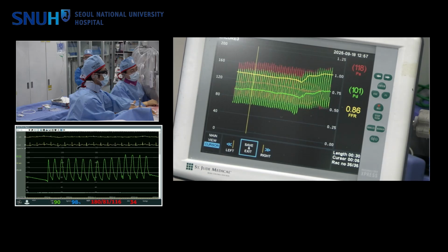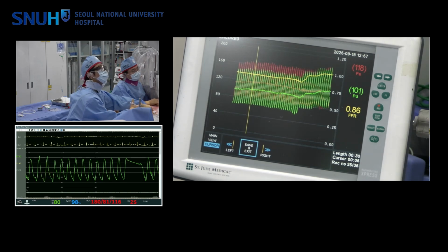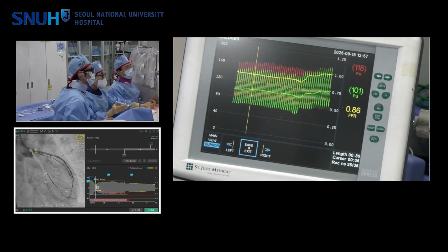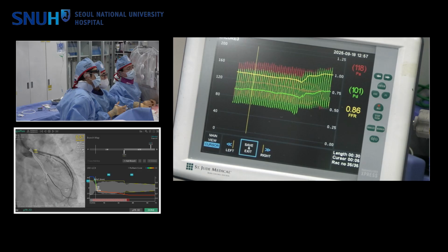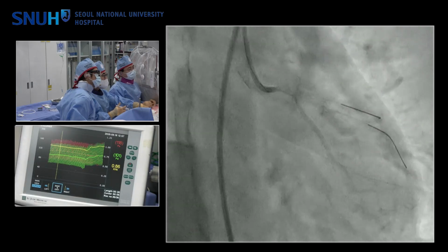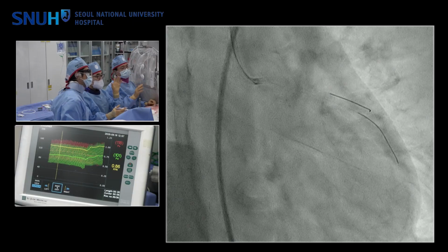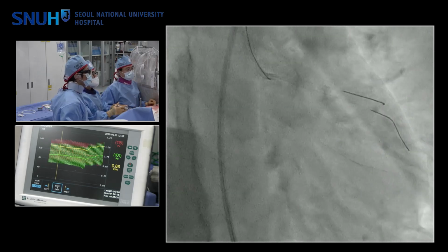How about taking the spider view to obtain a straightened LCX coronary angiogram? Okay, yeah. The foreshortening and the overall view is very good. Okay, test. Okay, we are going to take two MUFR views, the cranio-caudal view and the caudal view. Okay. Snap, please.